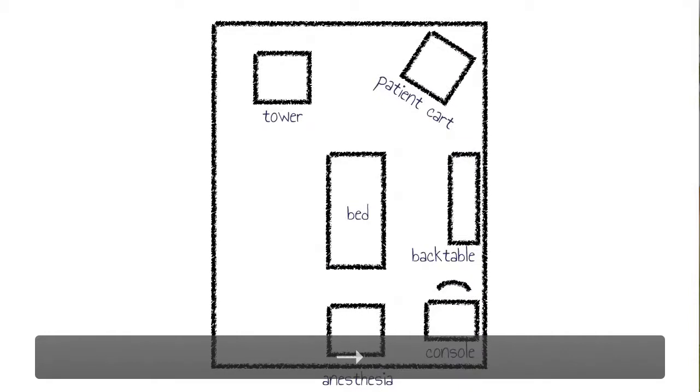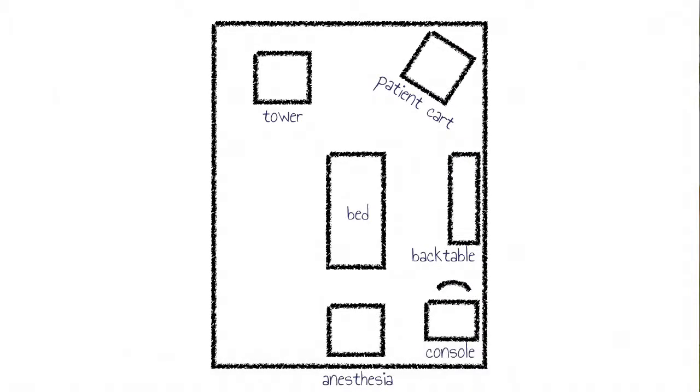Okay? So on the room layout end, it's amazing to me to walk into hospitals and see that, oh, when Dr. A does a robotic case, the patient cart's over here, and this is over there, and the Bovie's over there. But when Dr. B comes in, well, then we have to move the Bovie over here for him, and we rotate the bed this way because he does side docking, and we move the console over here. Total craziness.